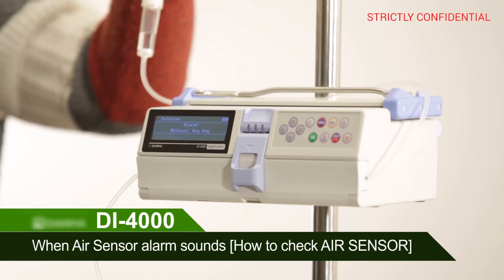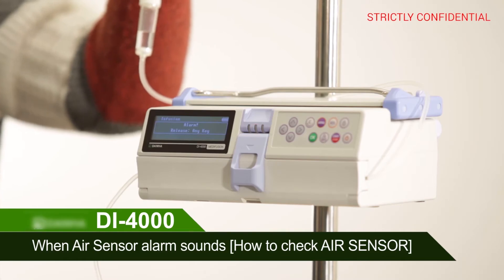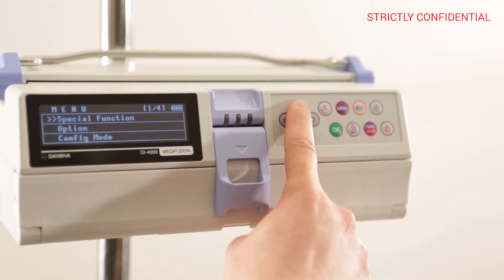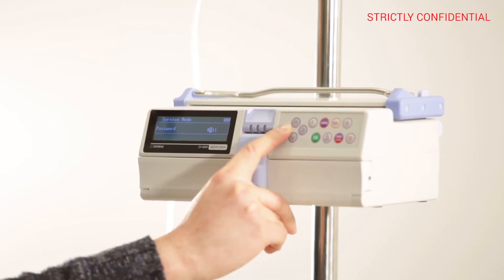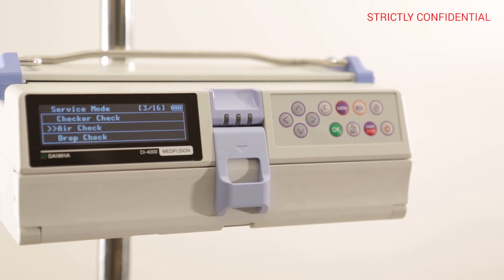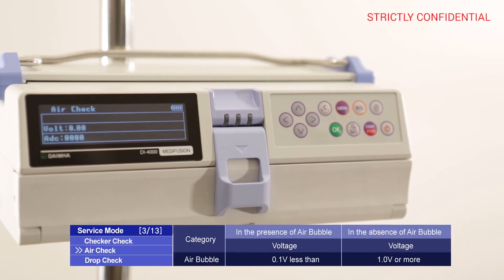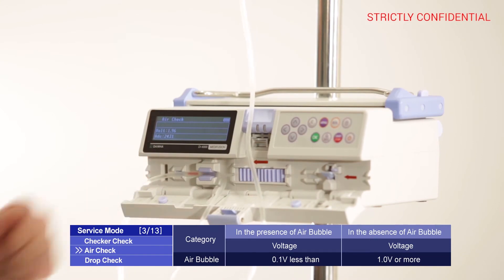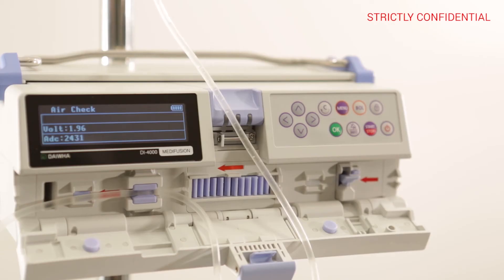When an air sensor alarm sounds, press the menu button and enter service mode, inputting 1711 as the password. Use the arrow keys to enter the air check. When the IV set is not installed, the voltage value is zero. If you open the door to install the IV set, the voltage value changes — check the sensor status by confirming the voltage value changes.